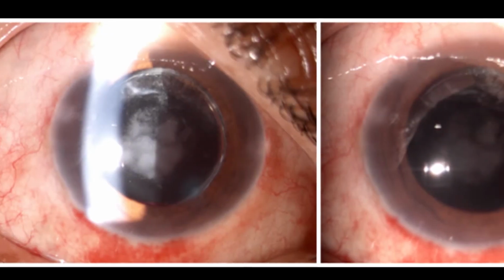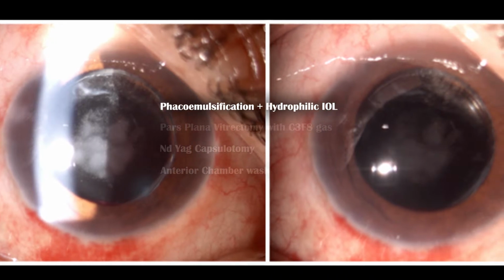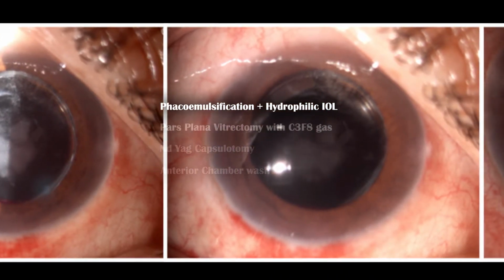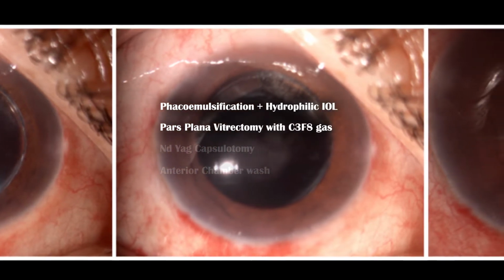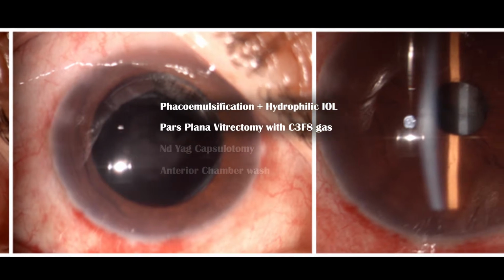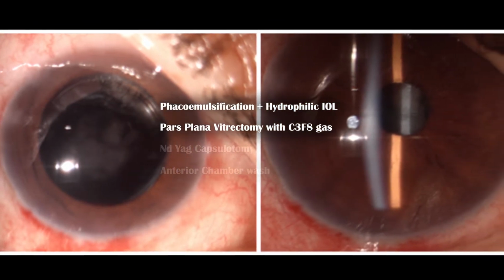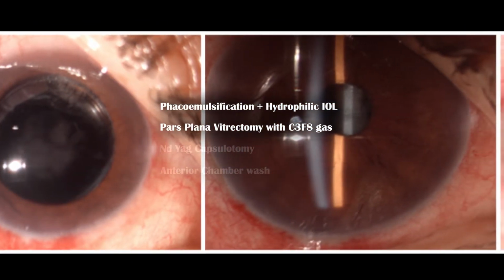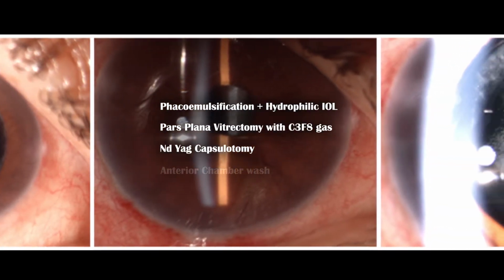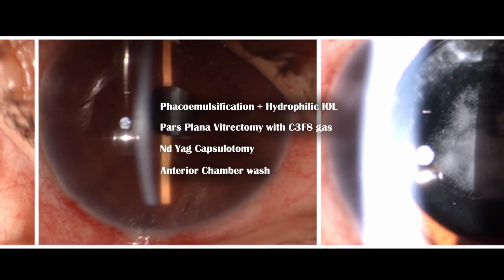Our first patient had undergone phacoemulsification with hydrophilic IOL in 2013. A year later, he underwent vitrectomy with C3F8 gas for the retinal detachment. After a brief period of clear vision, he developed blurring, for which he underwent futile attempts of YAG capsulotomy and anterior chamber wash.